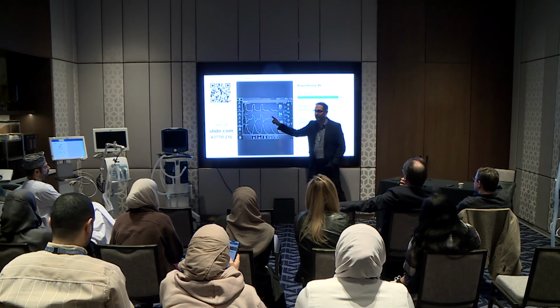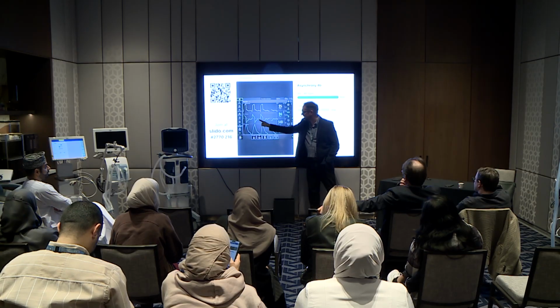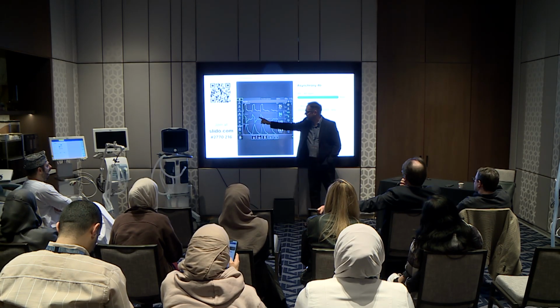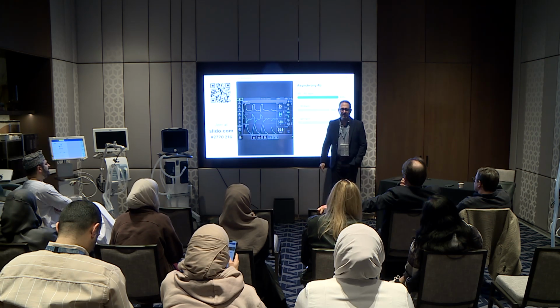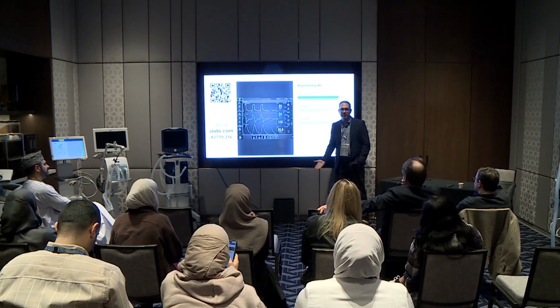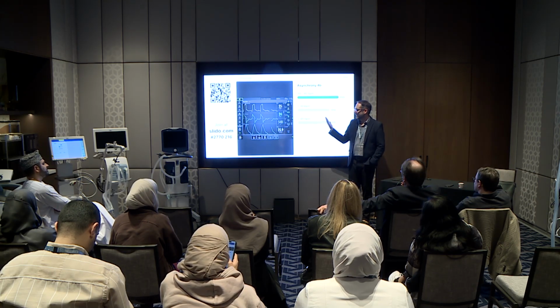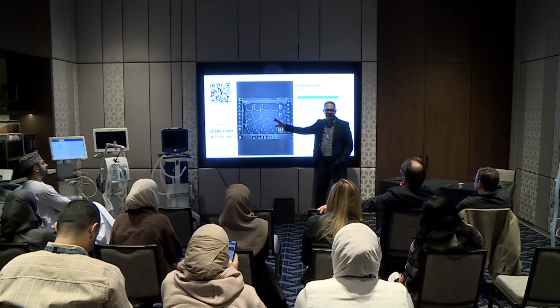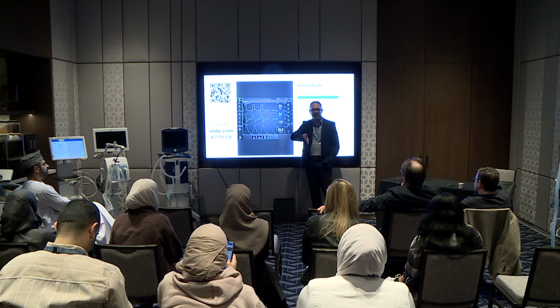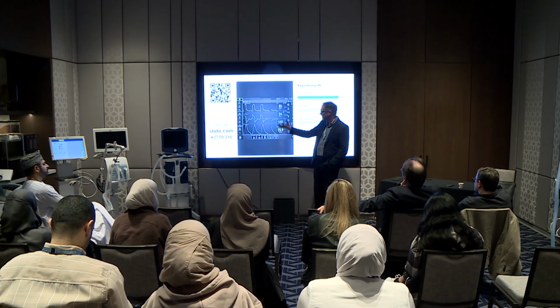A respiratory therapist who does not recognize this, or a nurse, whoever's adjusting the ventilator, goes in there and weans the pressure support. As soon as the patient starts triggering every breath, they think the patient is failing weaning, because the respiratory rate's now over 40. Technically they are, but it's no different. You've just unmasked it. They're still failing, even when you turn the pressure support up, there's still tachypnea. There's something causing them to breathe that fast, despite you giving them good tidal volume, et cetera.